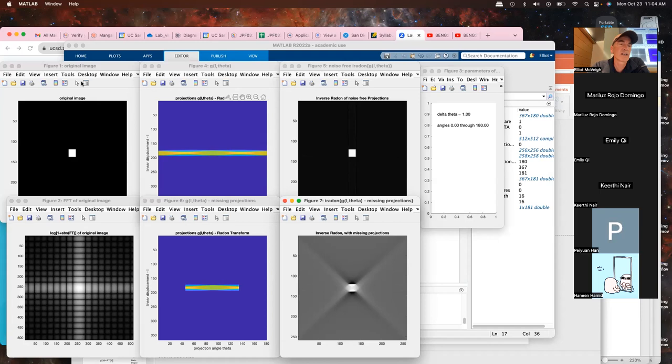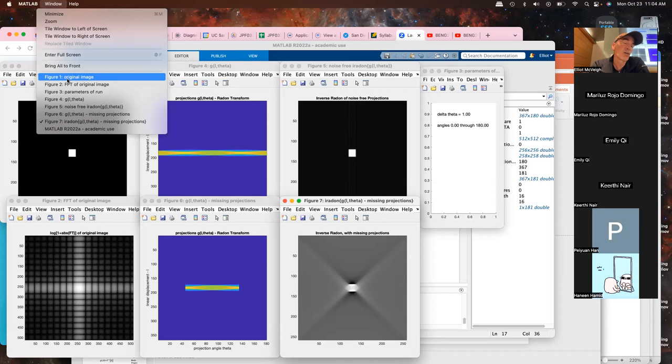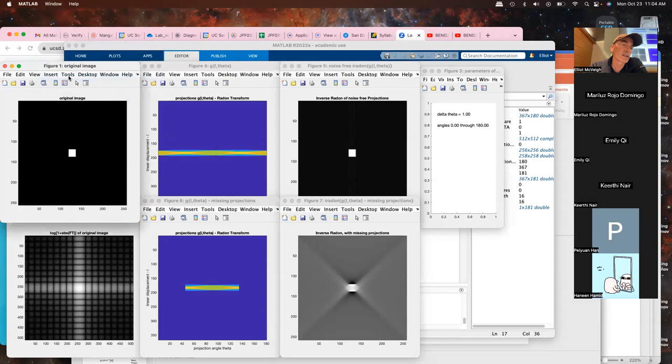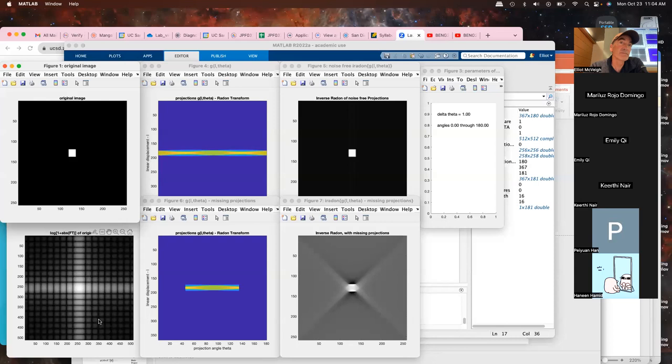In MATLAB, you can give your script a title so that when you pull down the figure list you know what you're looking at. Figure one is the original image — a 256×256 central square that is 16×16 pixels. We can also look at its Fourier transform to see what this thing looks like in Fourier space.